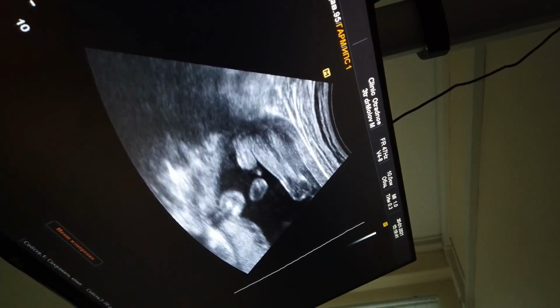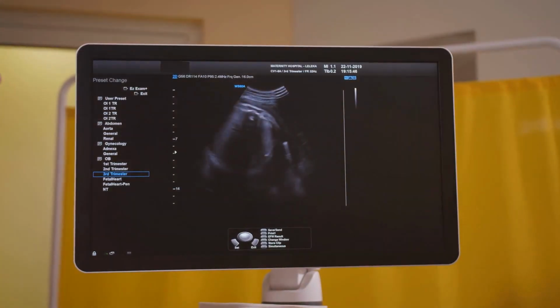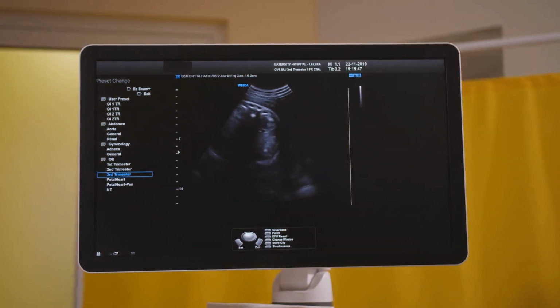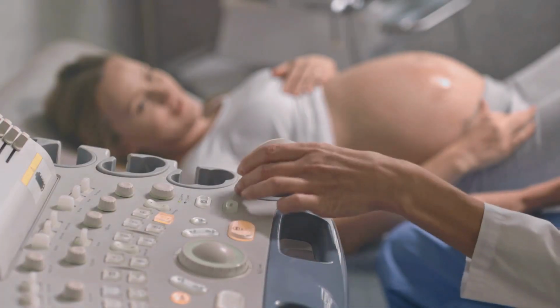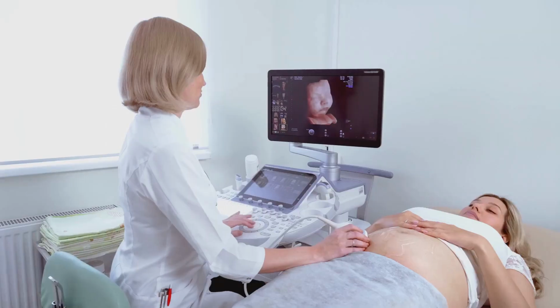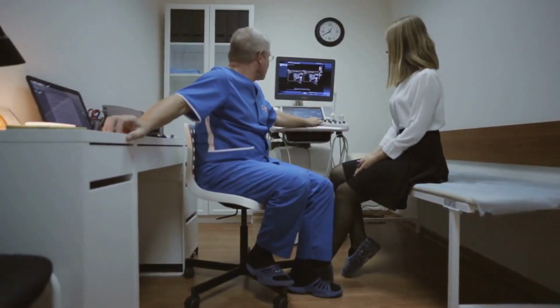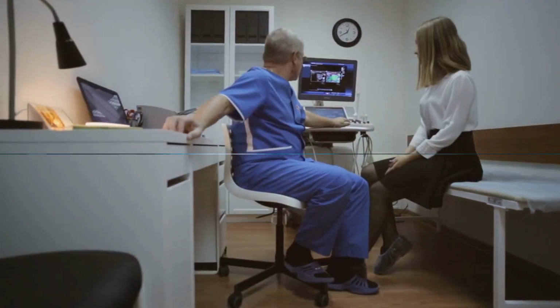It's like trying to take a picture of a moving object. The result is often blurry and unclear, but when the object is still, the picture comes out sharp and detailed. It's the same with an ultrasound scan. So, when the radiologist asks to hold the breath, it's crucial to follow the instructions. It's a team effort, with the patient playing a vital role in ensuring the scan's success.